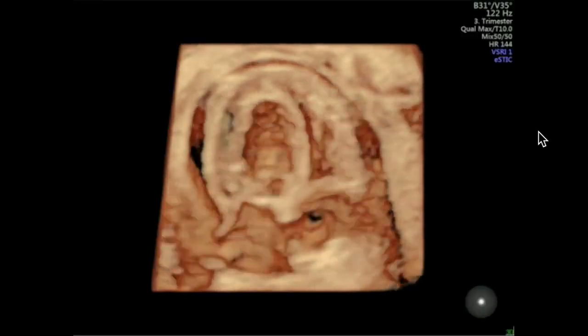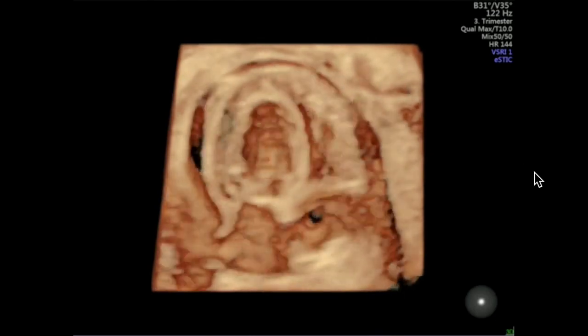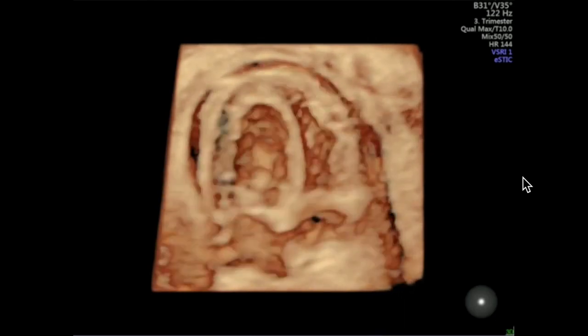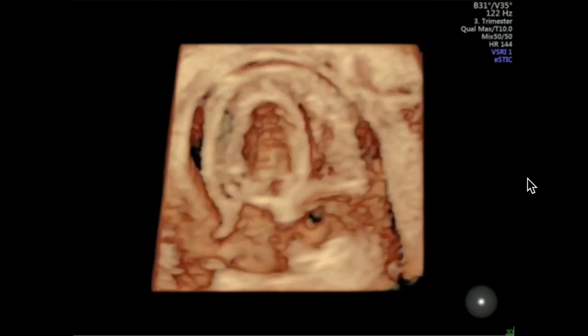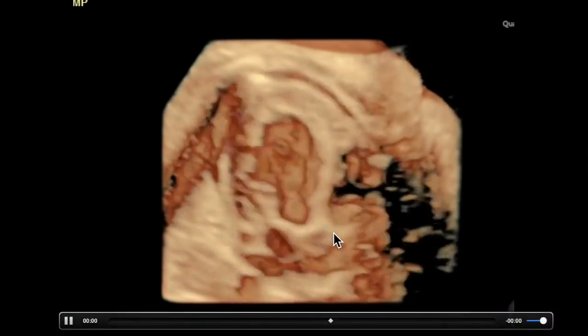Surface rendering, again, can be just surface rendering. So here we're looking at grayscale of a severe aortic stenosis with a kind of non-contractile ventricle. And here's looking up into the LVOT where you're really not seeing any significant opening of the aortic valve.